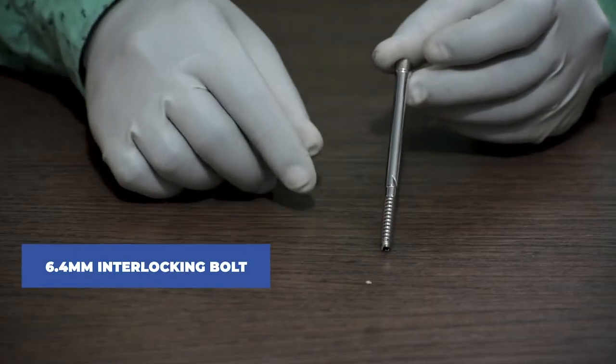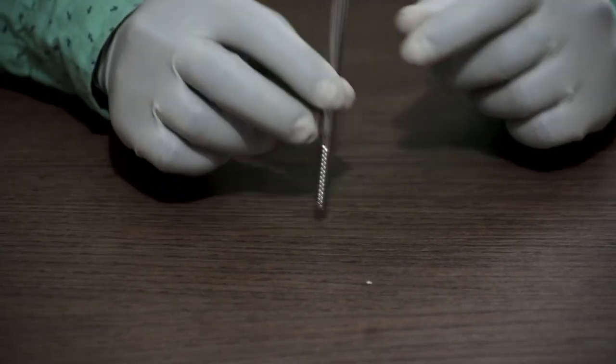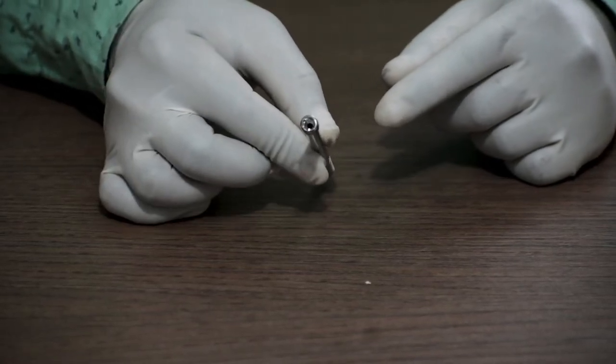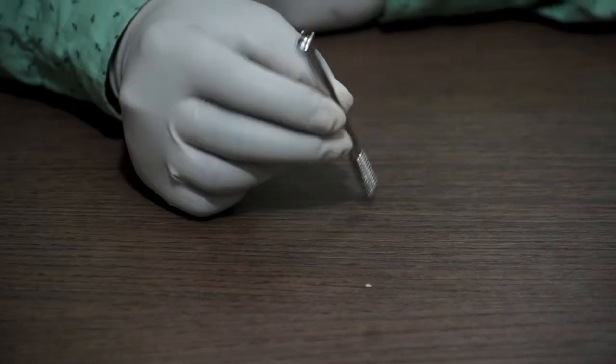This is a 6.4 mm interlocking bolt. It is available in the length from 50 mm to 120 mm. This interlocking bolt is cannulated. This is used to fix the proximal end of the nail.